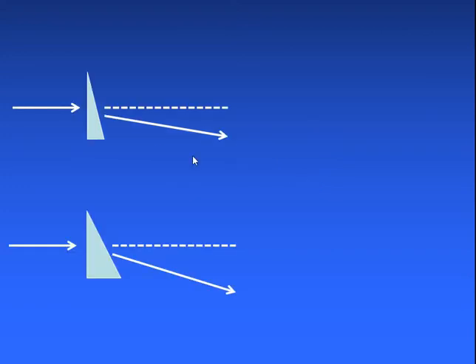And if we have a thicker prism, then it will influence the light more and change the angle to a greater extent. And we can actually quantify, give numbers to this. This is less critical for a medical student to understand, but it's very important for someone in the field of strabismus to do measurements with. That we know that this prism is thicker and more strong than this prism.